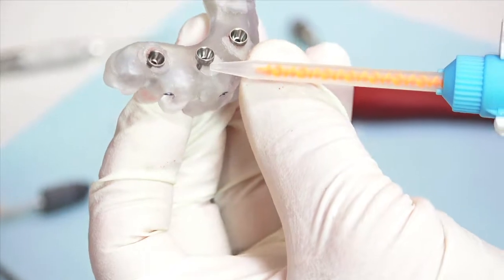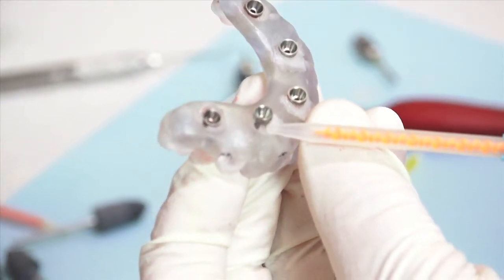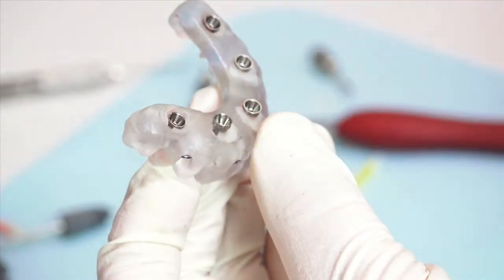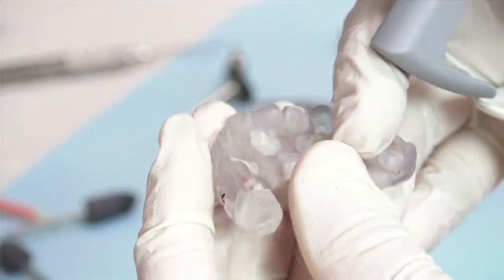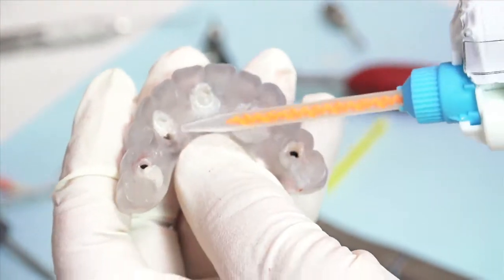Evaluate both the tissue side and the occlusal side of the clear duplicate bridge and fill in any voids as needed to help secure the temporary cylinders to the clear duplicate bridge.